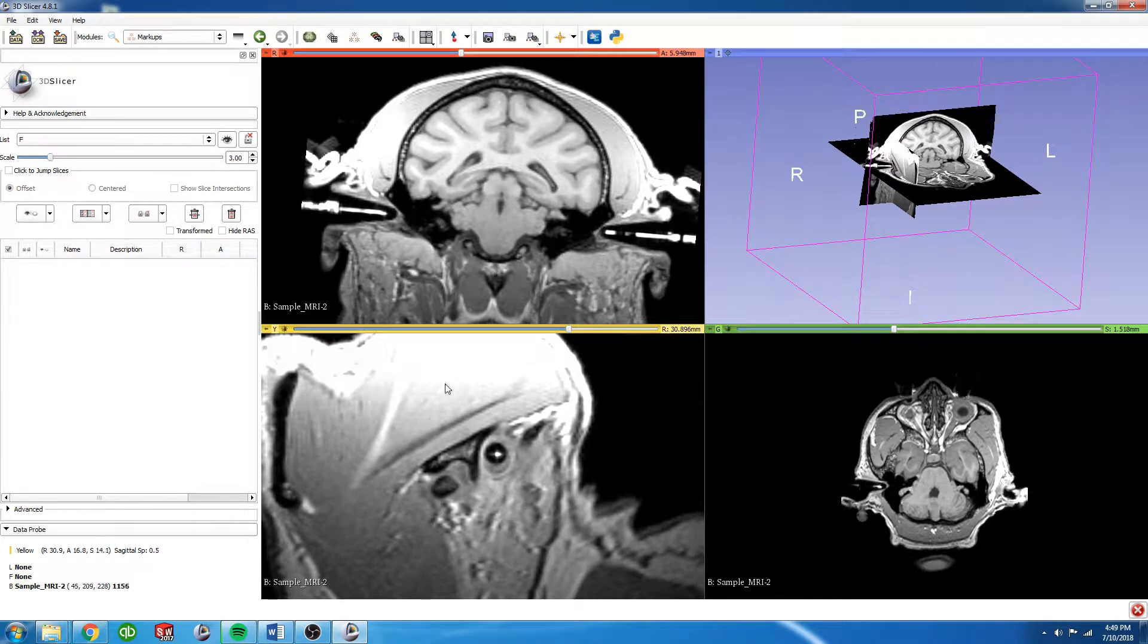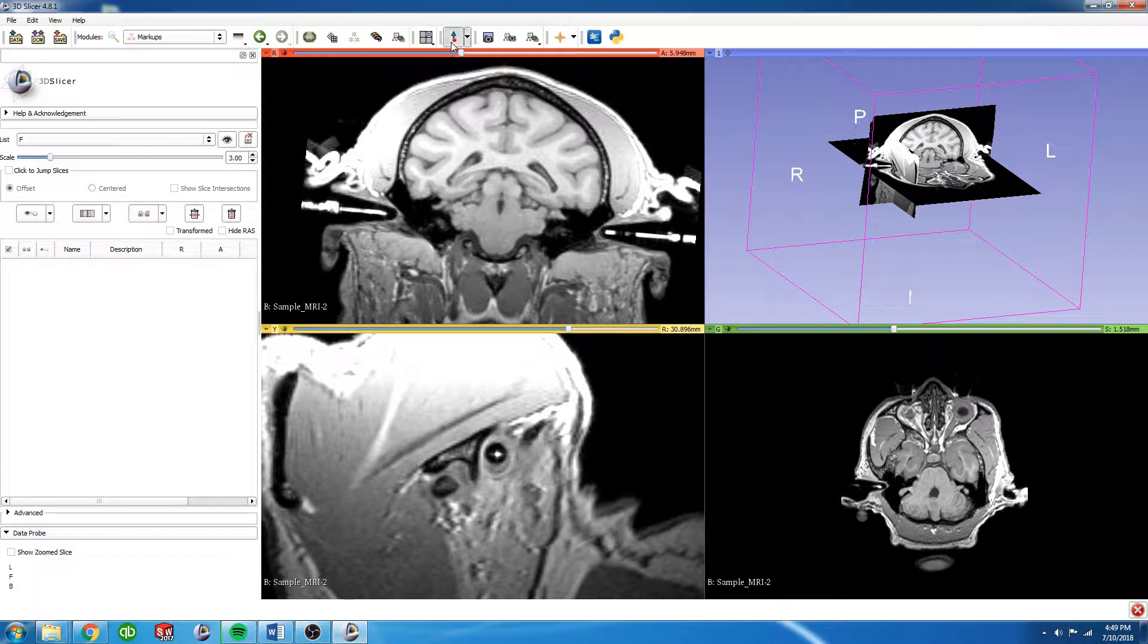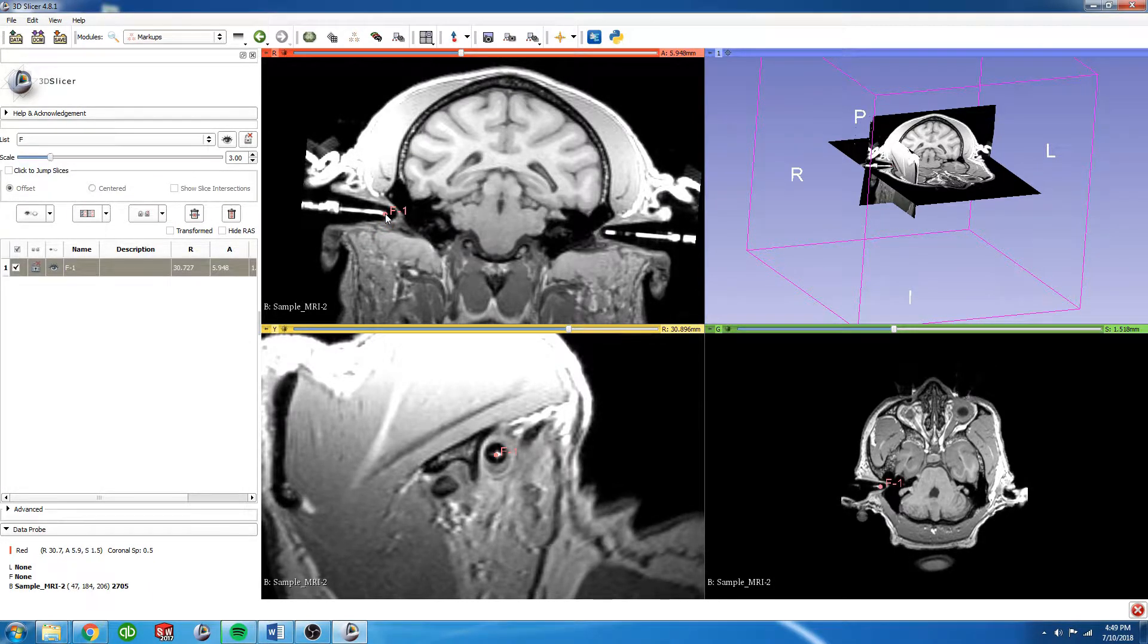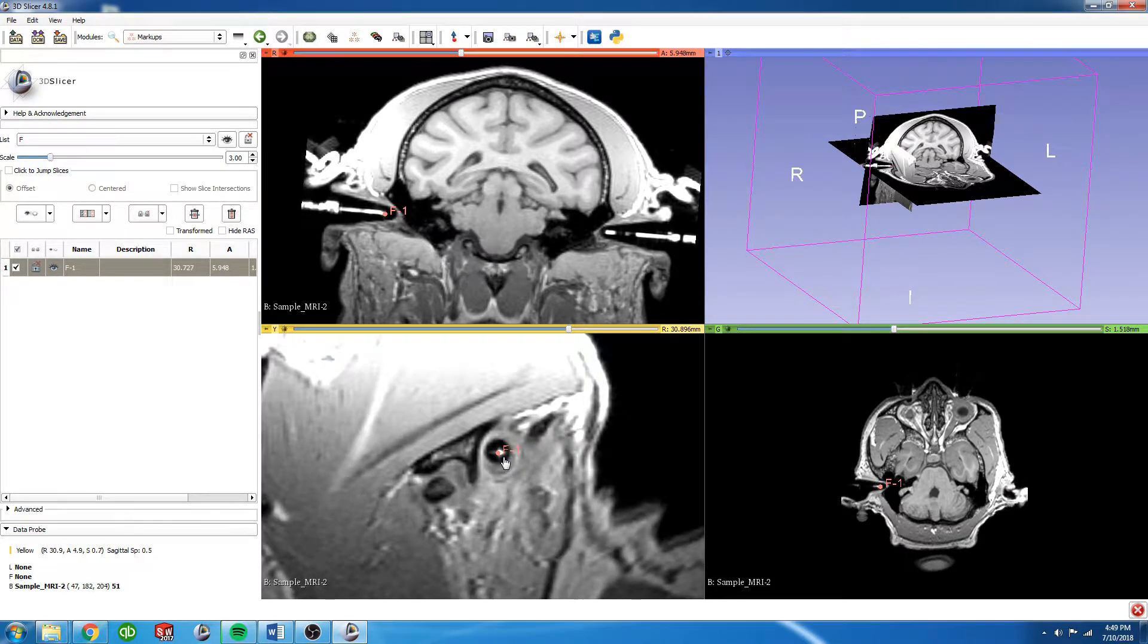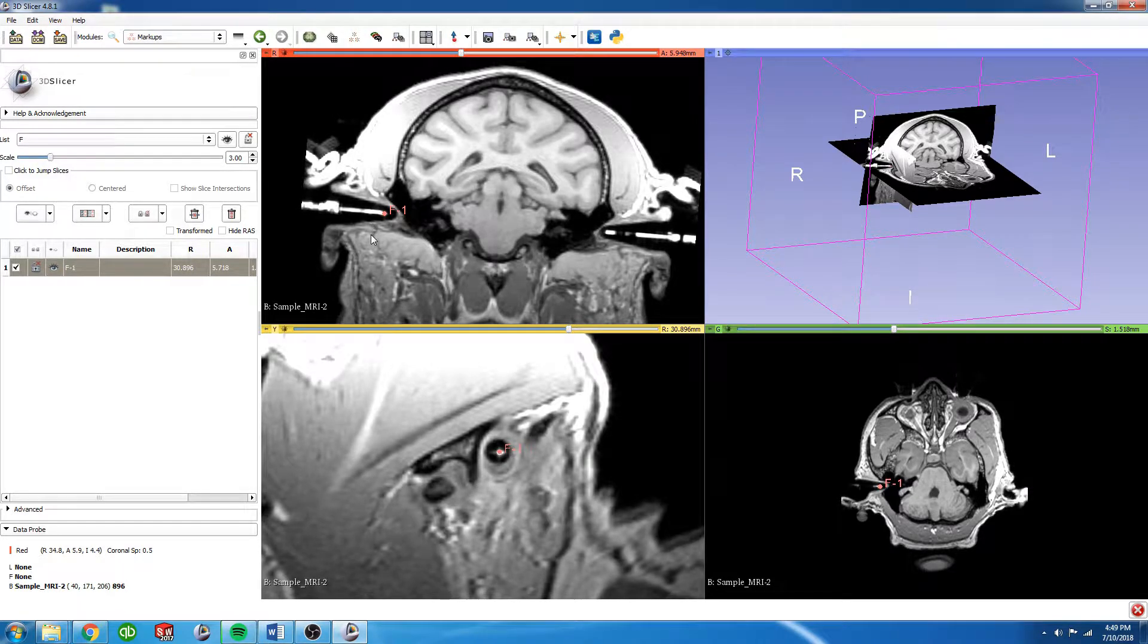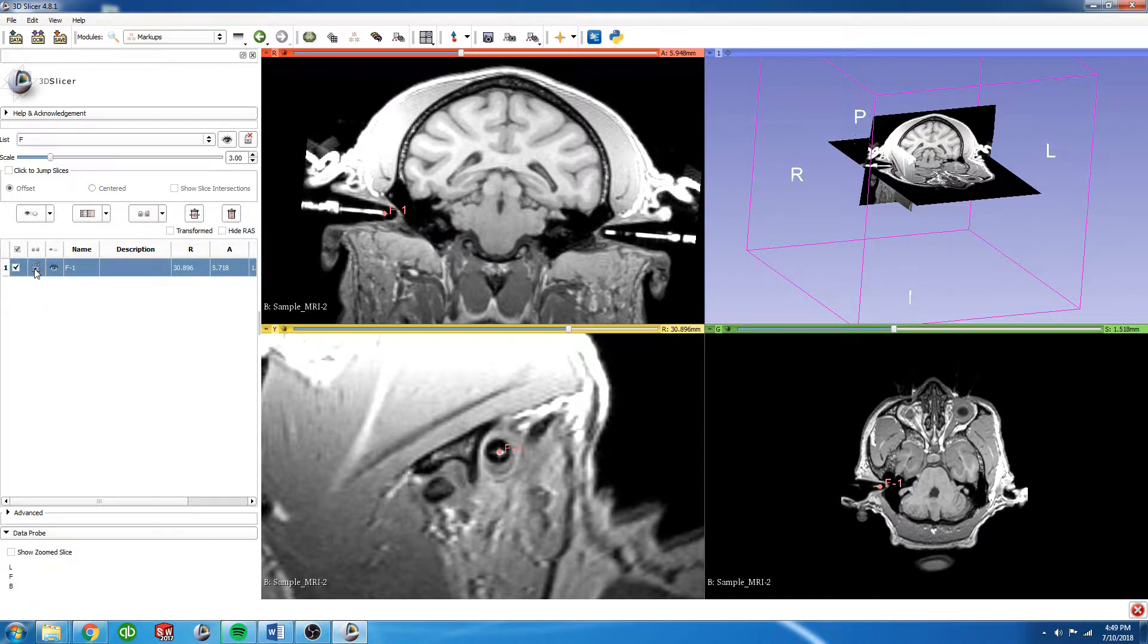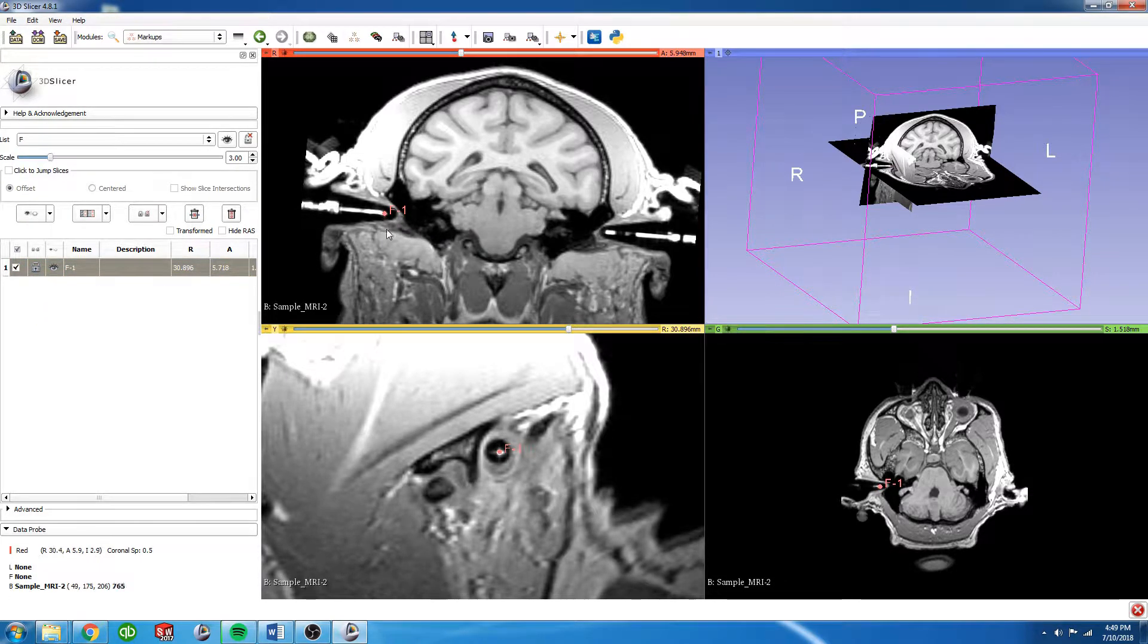Now we're going to go up to here to this fiducial button, click that, and I'm going to place the fiducial at the tip of that ear bar. You'll see in the sagittal view it's a little bit off, so I'm going to drag it more towards the center, double check here, and it all looks good. Now I'm going to hit the lock button here, and this makes it so I can no longer drag this fiducial—it's locked.